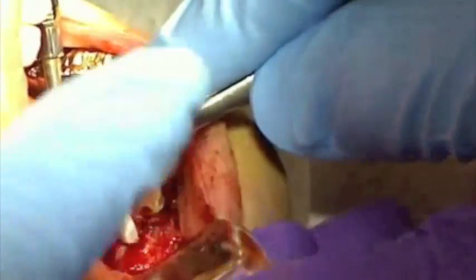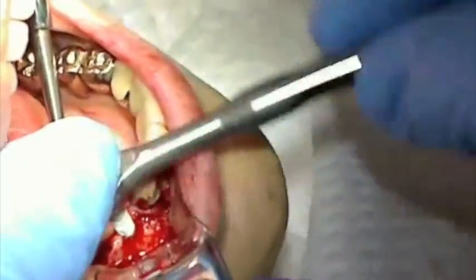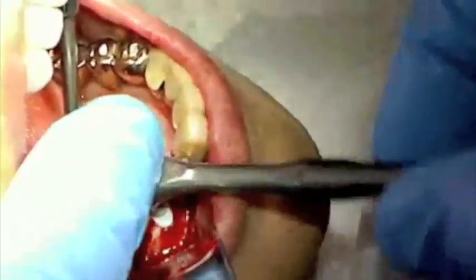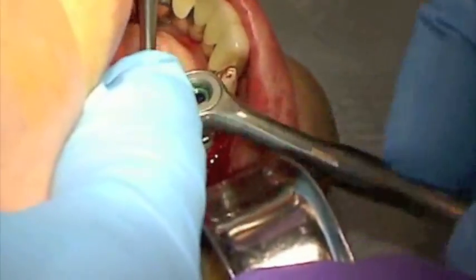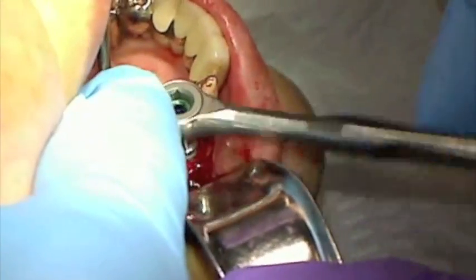The implants are suspended in their sterile vials with the unique transfer abutment system. The implant is then transferred to the osteotomy using either mechanical or hand pressure to start. The implants are then seated completely with either ratcheting, as you see in this video, or with slow speed handpiece.